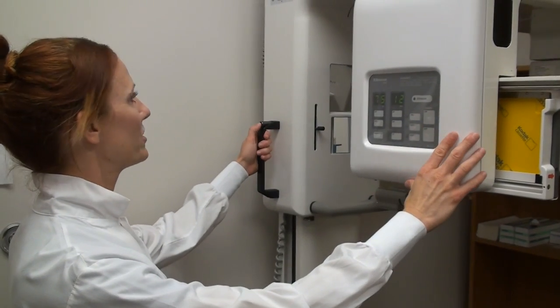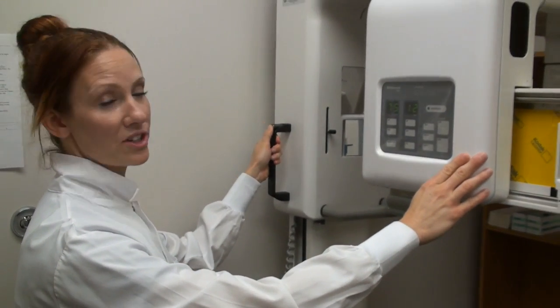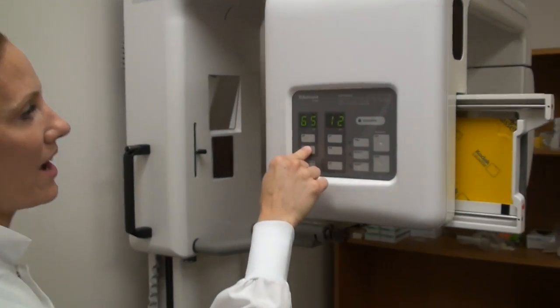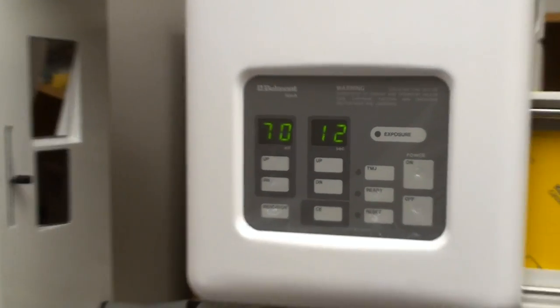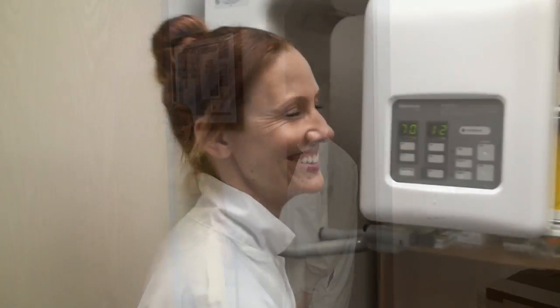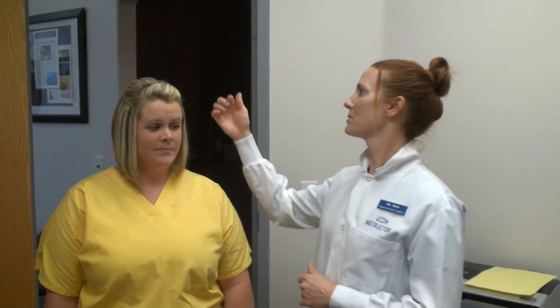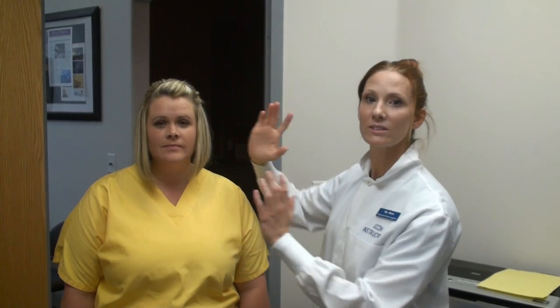Make sure that the unit is on and adjust the height of the machine using the handle with the button. Adjust your KVP before you forget — hold it up to 70 for now. Make sure you're staying tuned to your UCDH channel for any updates and changes. Check that your patient doesn't have any eyeglasses, earrings, necklaces, any other metal jewelry, or any removable appliances. With women, sometimes you need to check carefully for bobby pins. She does have some bobby pins, but they're going to be out of the range of where the film will be, so we're good to go.